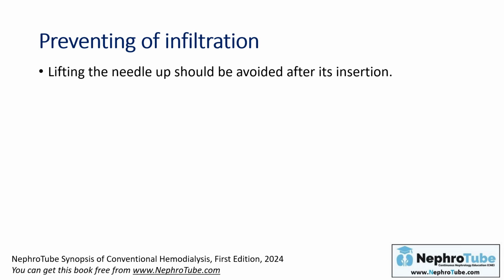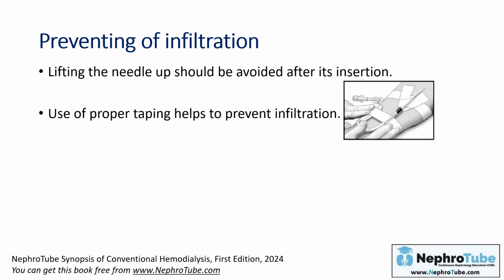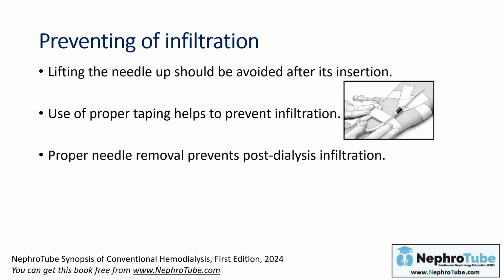First, avoid lifting the needle up after insertion. Second, you have to use proper taping to fix the needle to prevent infiltration. The third, proper needle removal is important to prevent post-dialysis infiltration.